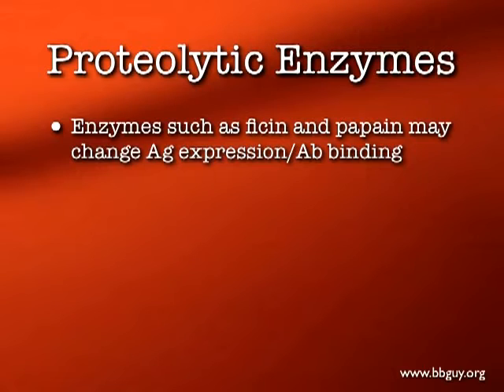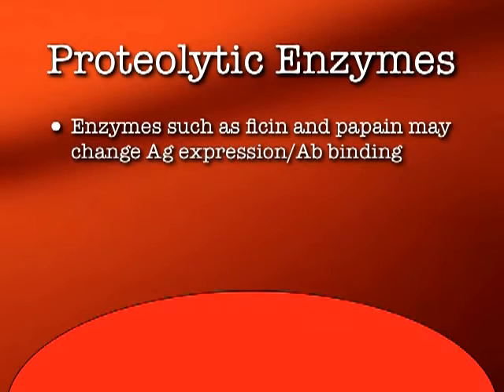So in the last podcast, we talked about the fact that enzymes like ficin and papain can change antigen expression. They may either increase or decrease antigen expression, or increase or decrease the availability of those antigens to bind to antibodies. Here's what I mean by that.